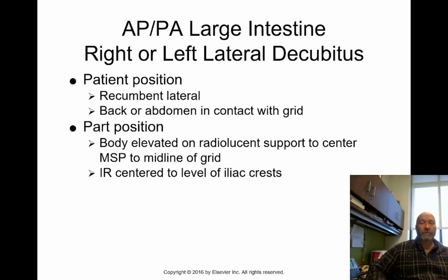So now we get to truly some new images, and that would be your left and right lateral decubitus. I'd mentioned this in the solid column BE, and that was to write down on a card what you're going to do. So you do AP, RPO, LPO sigmoid if that's your routine, lateral, LAO, PA, RAO. And we'll get to a rectum.